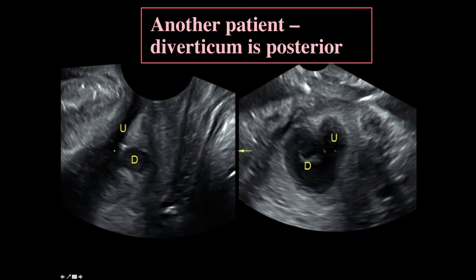A lot of times you can't see the connection. A lot of times you see the urethra and you see a little area and there's no connection. And it's not because the connection isn't there. Sometimes it's just obscured by debris or whatever else is there. But these patients have pain on urination, perineal pain.